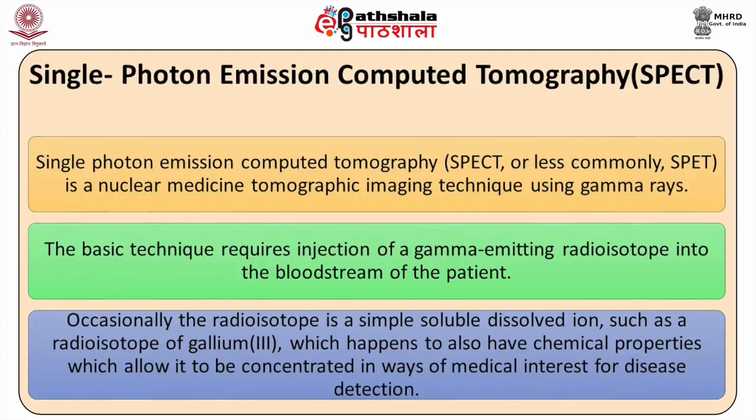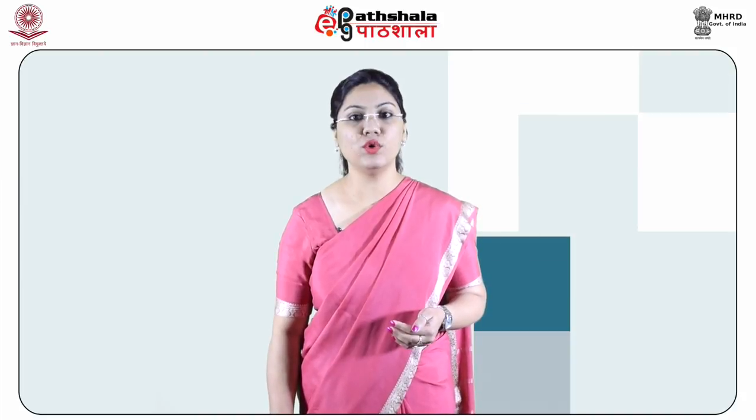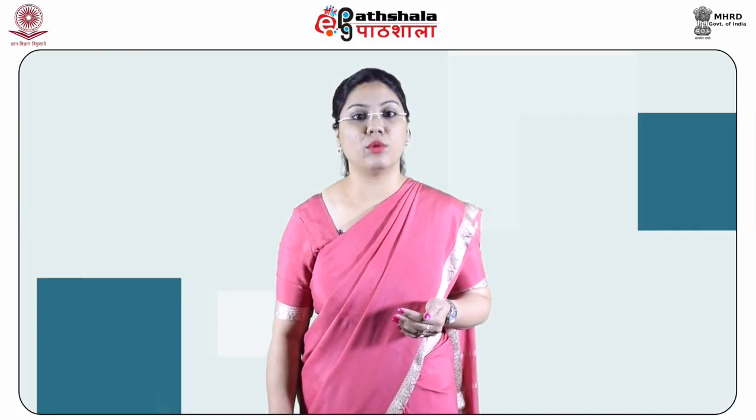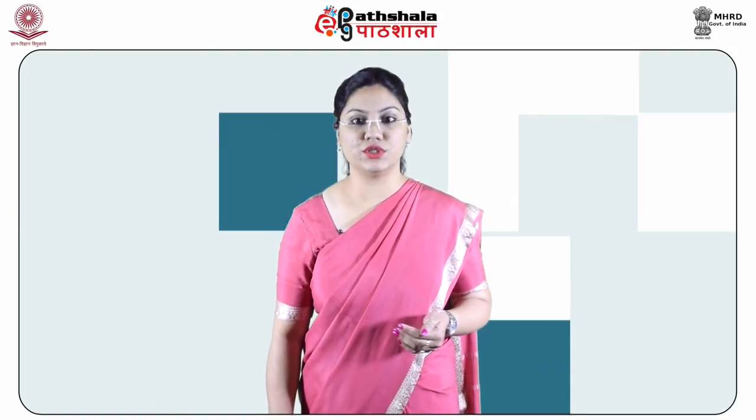Occasionally, the radioisotope is a simple soluble dissolved ion such as a radioisotope of gallium-67, which happens to also have chemical properties which allow it to be concentrated in ways of medical interest for disease detection. However, much of the time, in SPECT a marker radioisotope, which is of interest only for its radioactive properties, has been attached to a specialist radioligand, which is of interest for its chemical binding properties to certain types of tissues. These combinations allow the ligand and isotope, the radiopharmaceutical, to be carried and bound to a place of interest in the body, which then, due to gamma emission of the isotope, allows the ligand concentration to be seen by the gamma camera.